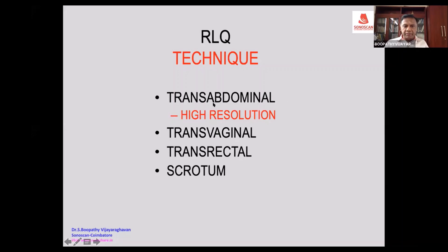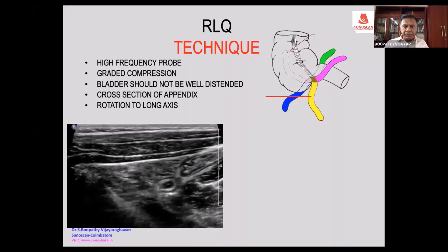In a transabdominal scan, use the high-frequency linear probe at 5 to 12 megahertz, and scan the right iliac fossa. You have to follow the graded compression technique.